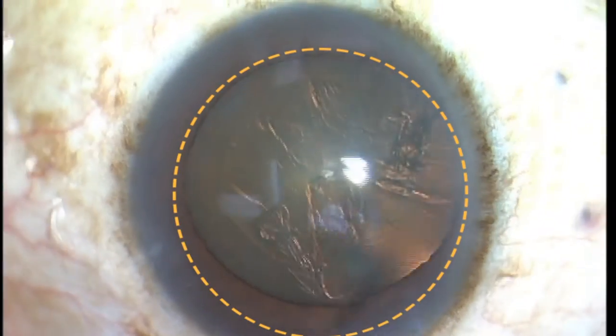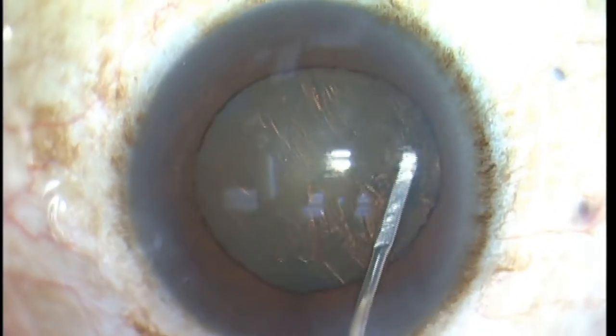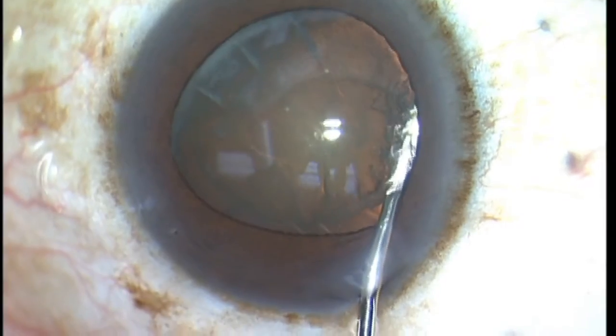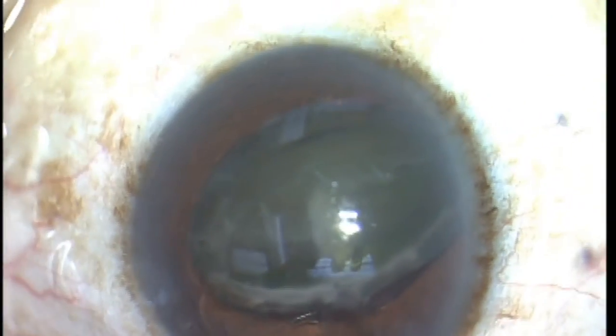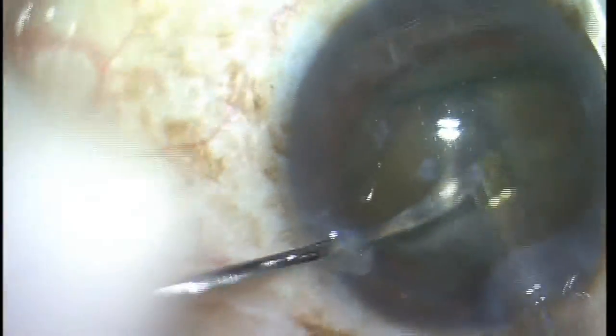Sometimes we are fooled by what the pupil does during the cataract procedure. This is one of my patients — the pupil looked nice and dilated, and this patient did not have a history of any Flomax or similar medication use. So this is my flip and slice technique, a supracapsular cataract disassembly technique.